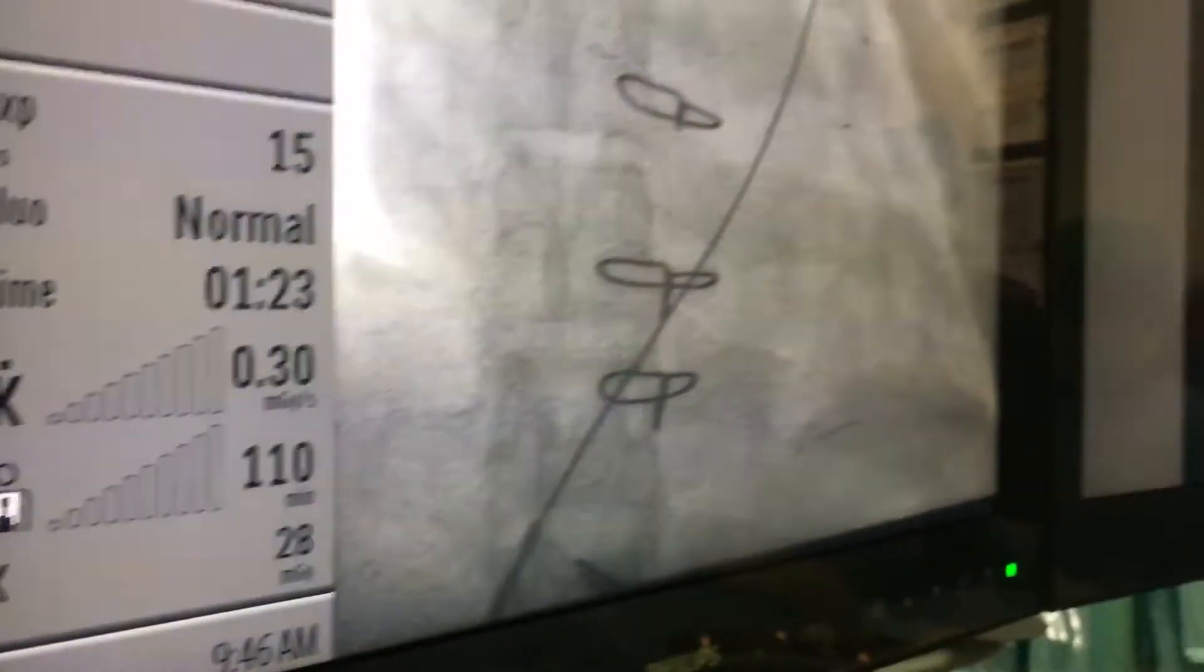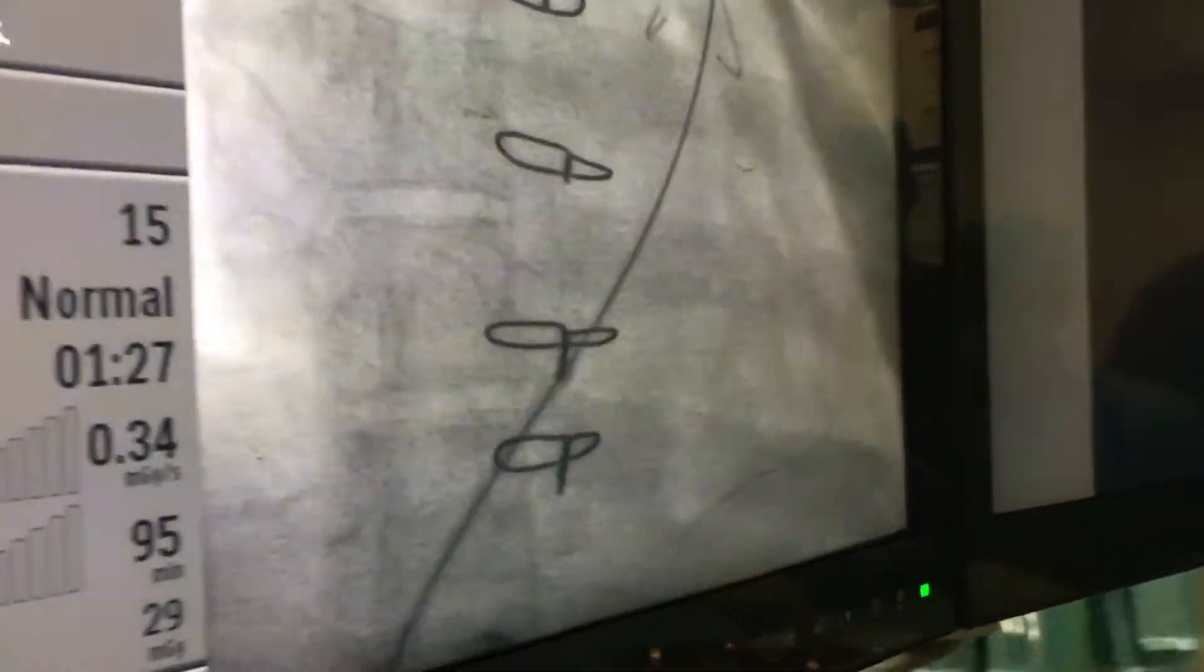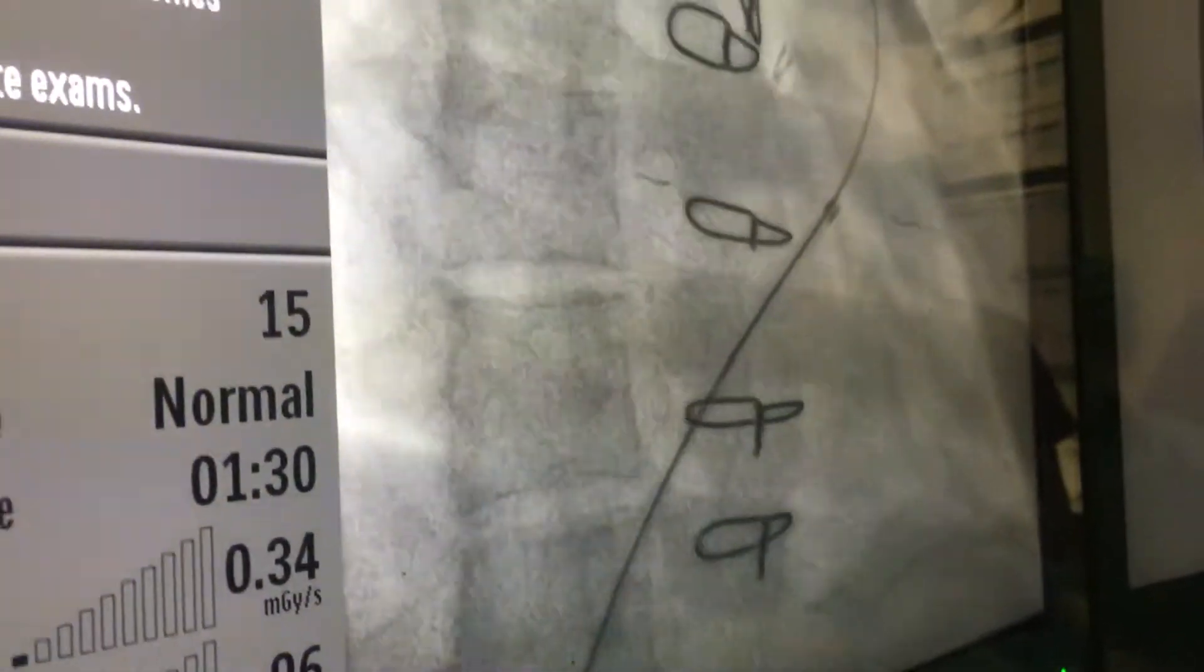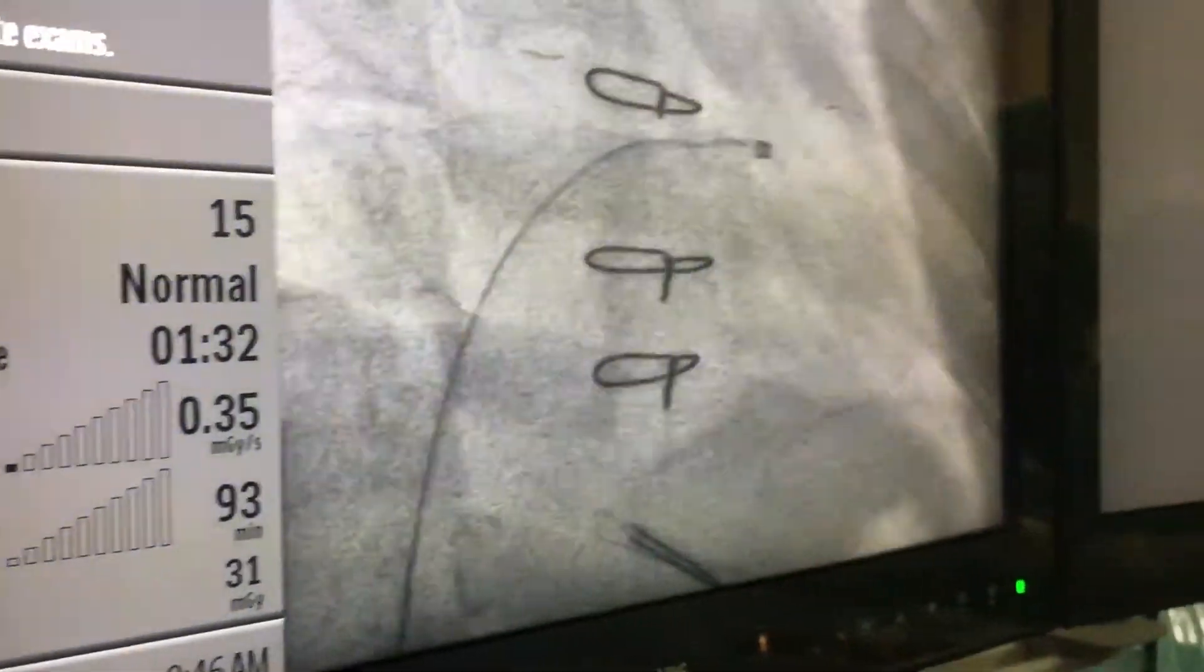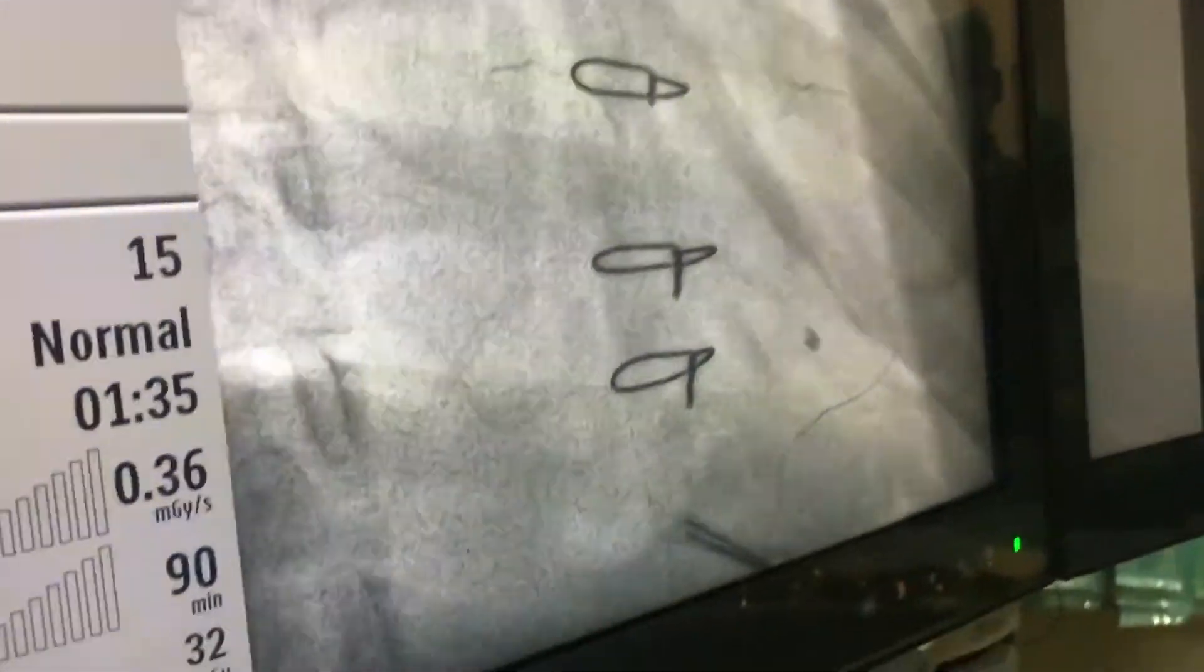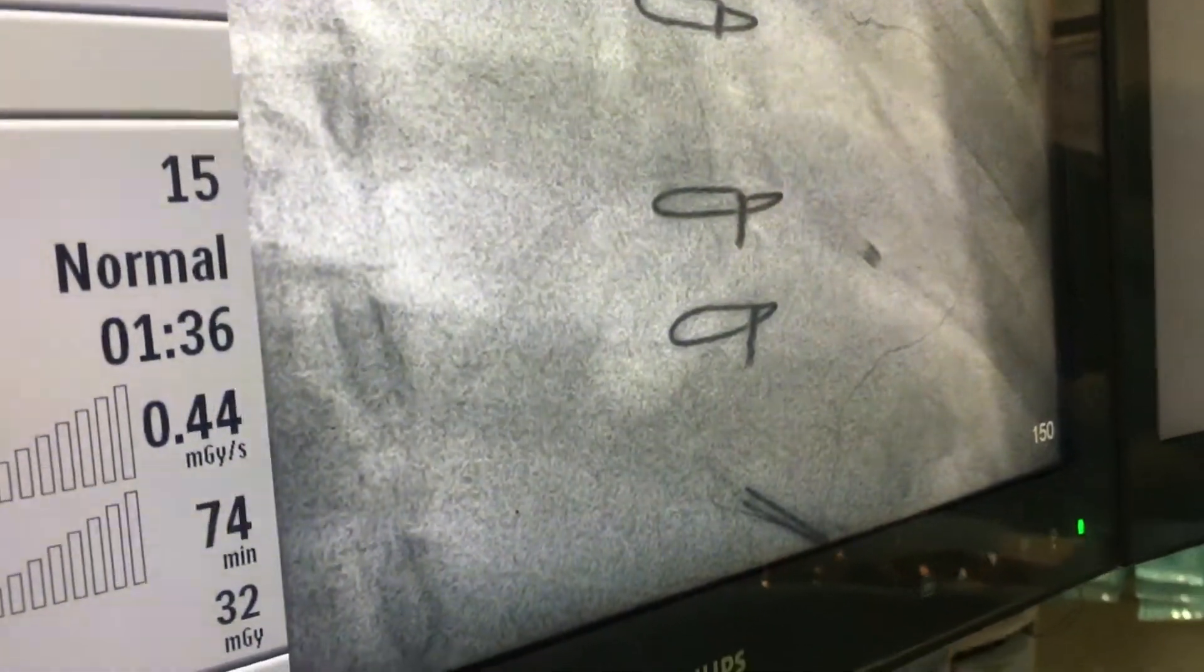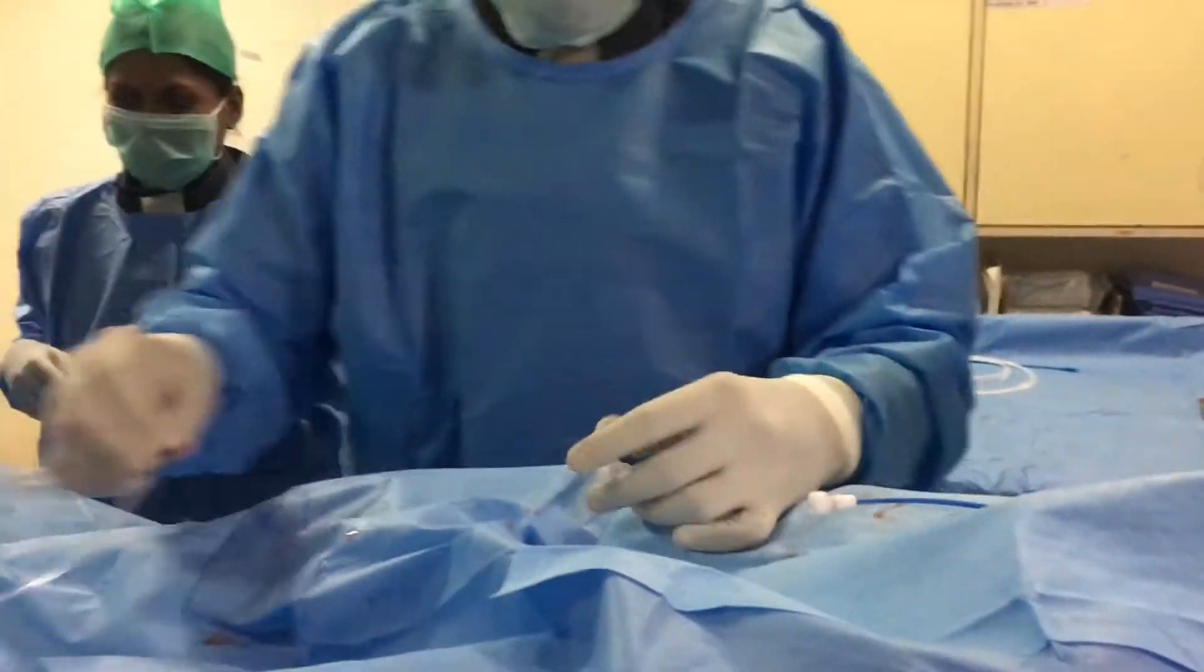Yeah, so now I'm just looking there. I'm just reaching there. There's an introducer inside that. Come to RAO. Once I'm just going into close to RV PA, then I just slowly... So no need to go into PA. We already measured the pressure in PA. We need only RV. We need to enter RV. Okay, so I just removed the wires.